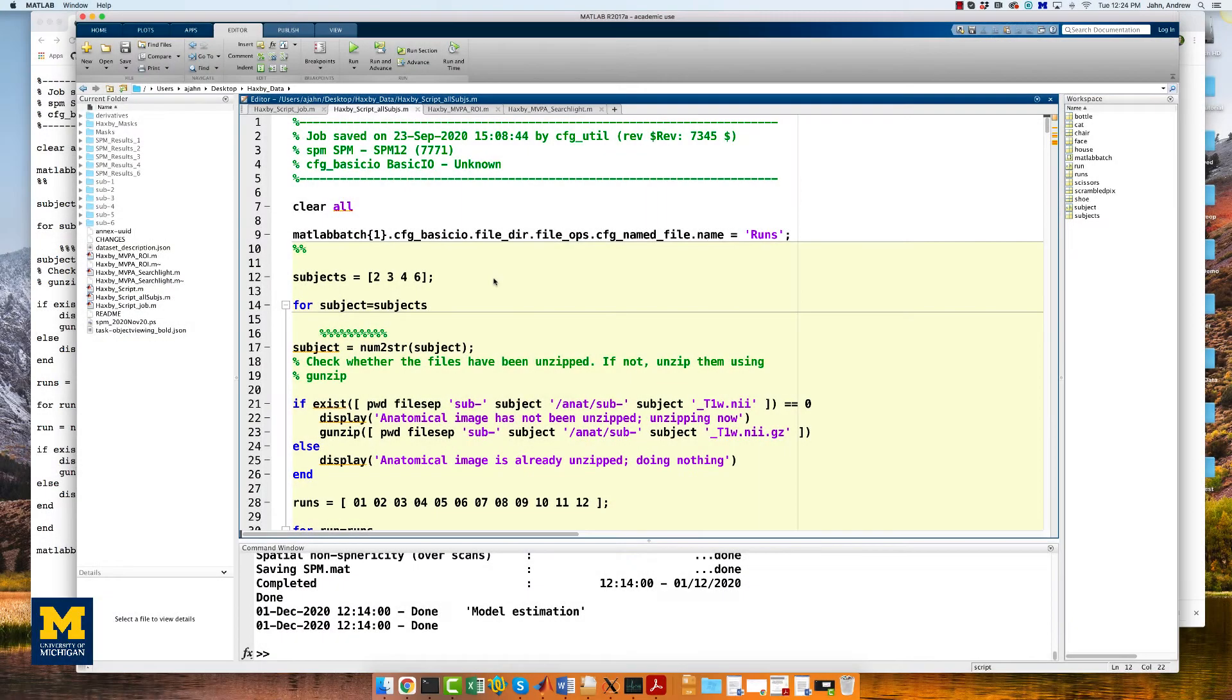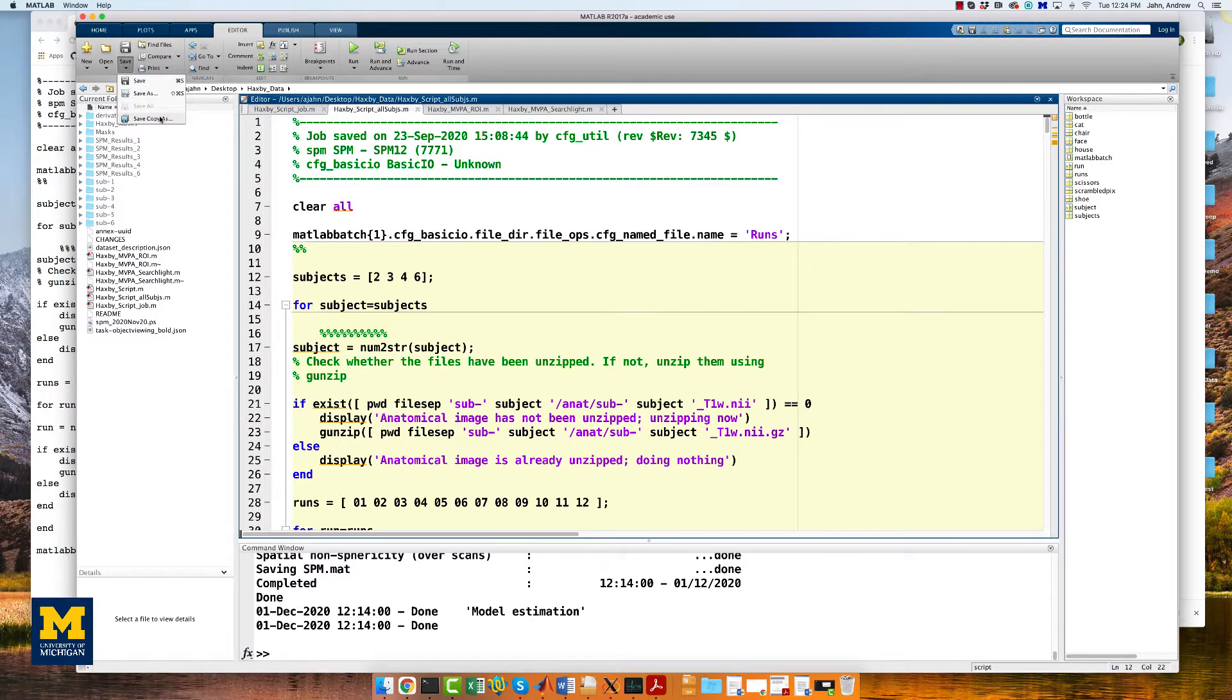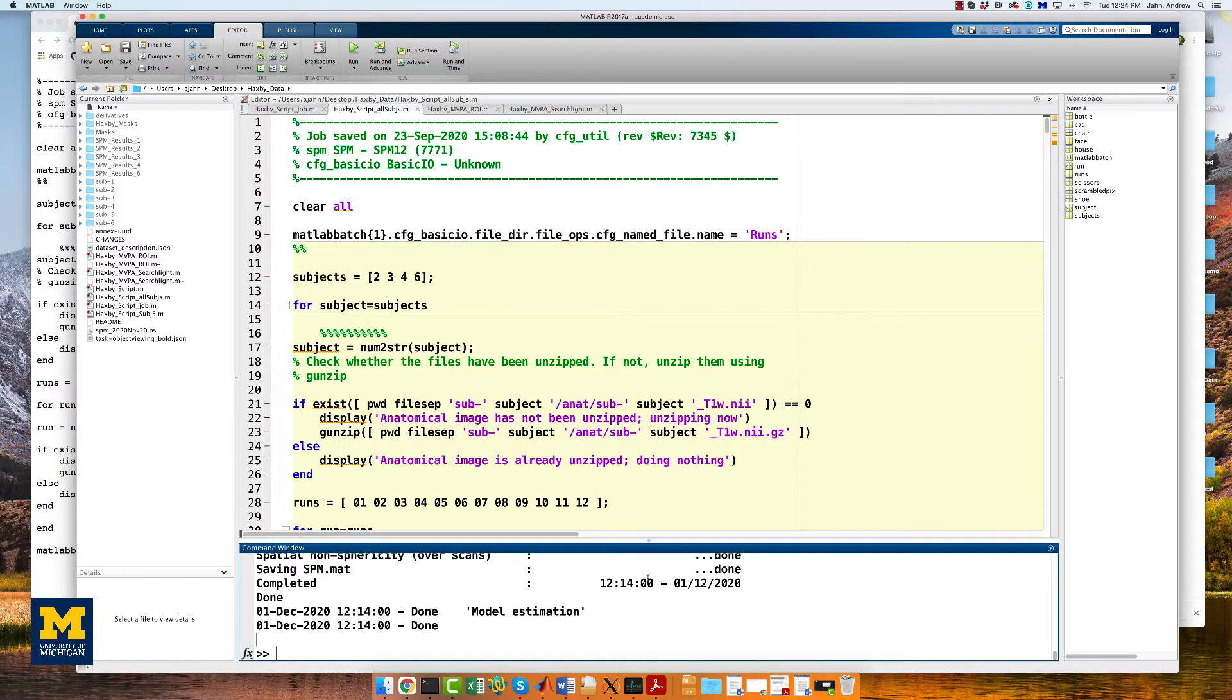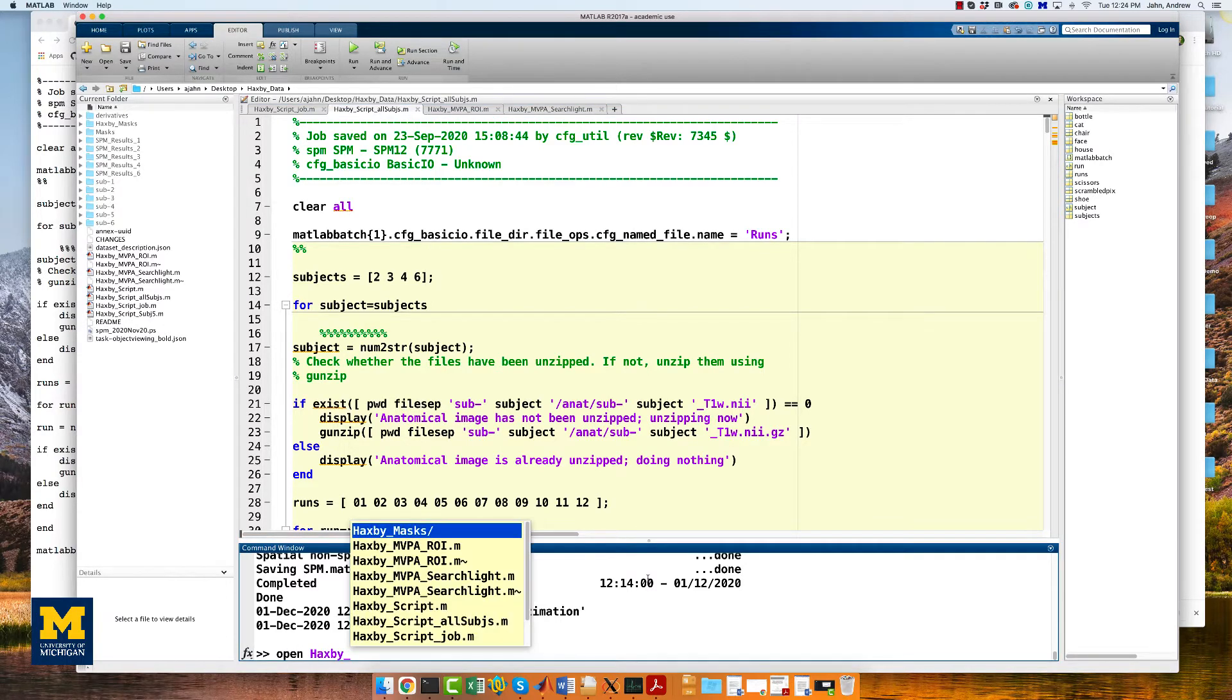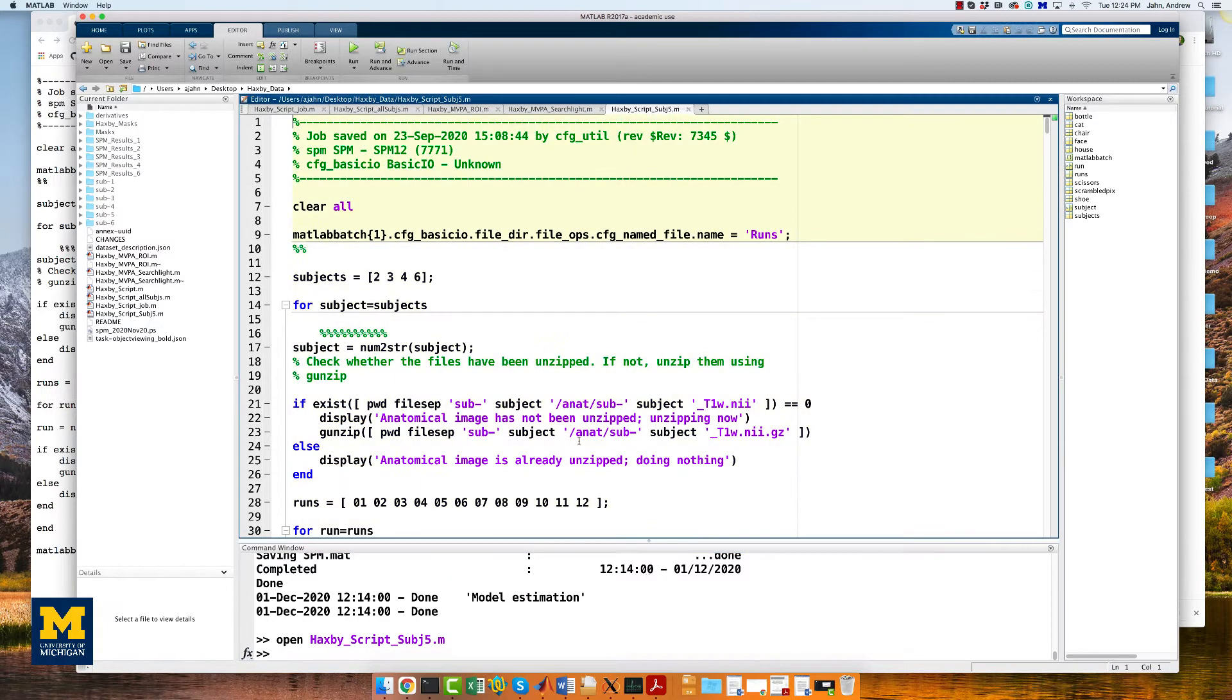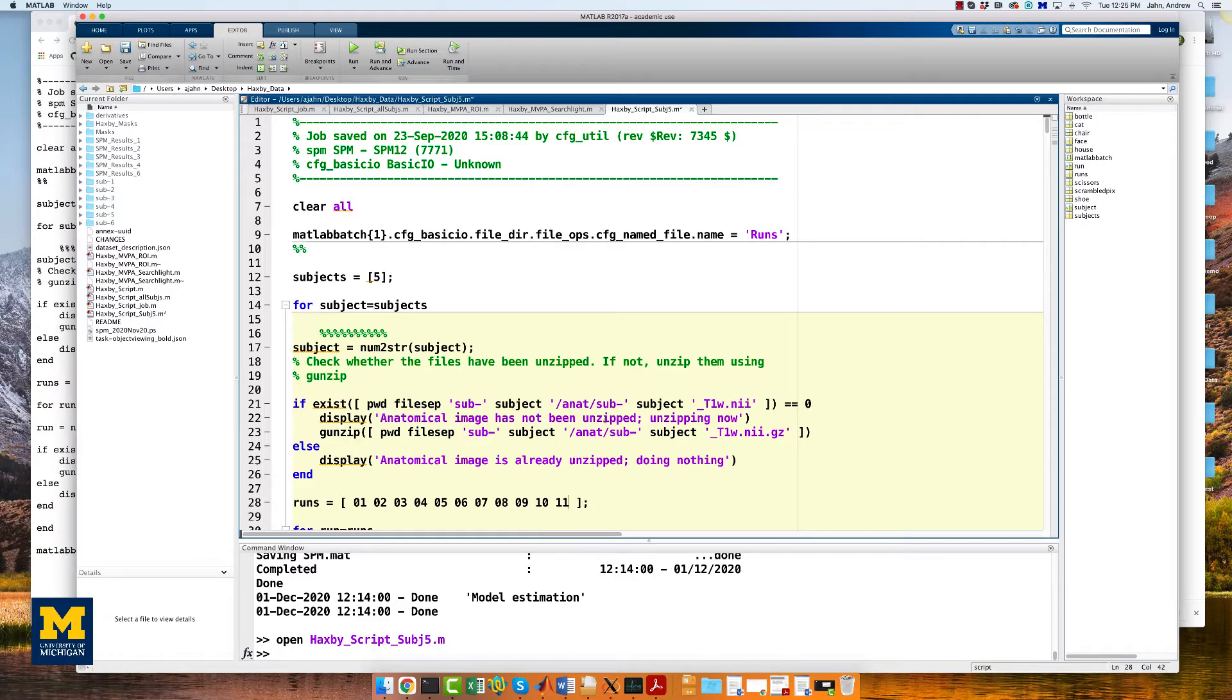Once we've finished pre-processing those subjects, we will need to do the same thing for subject number 5. So first, save a copy of this script. I'm going to call it Haxby script subject 5. And then open it in the MATLAB terminal. The first thing that we're going to change is in the subjects vector, replace those numbers with the number 5.